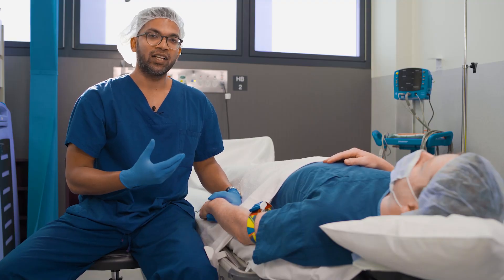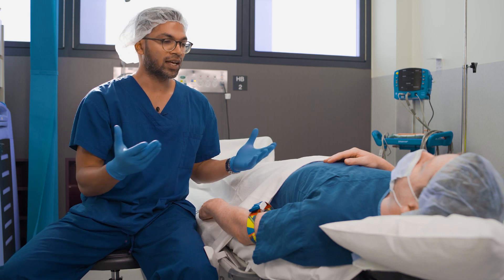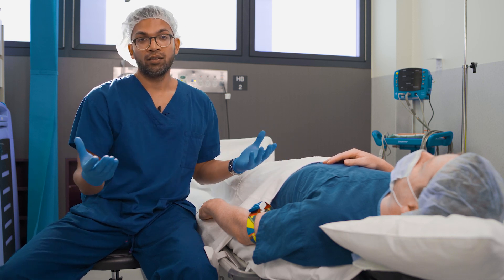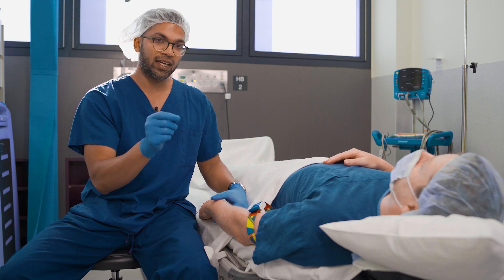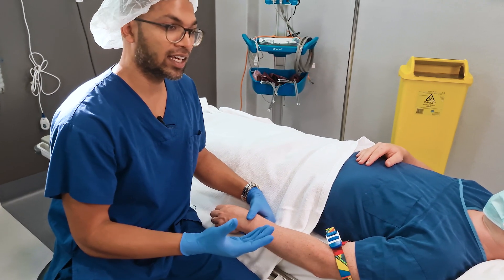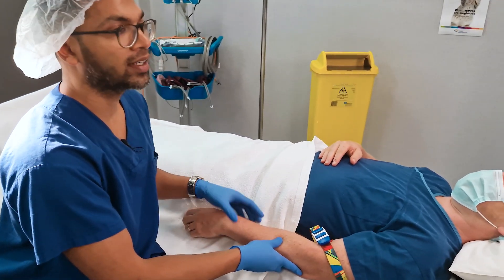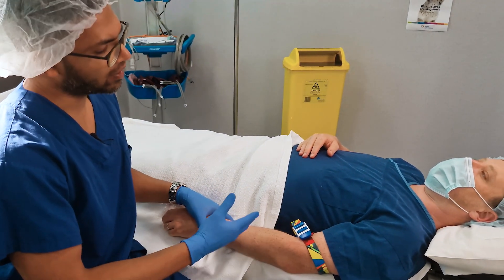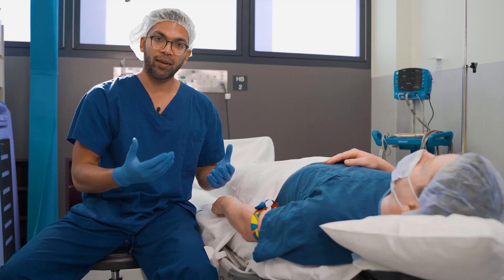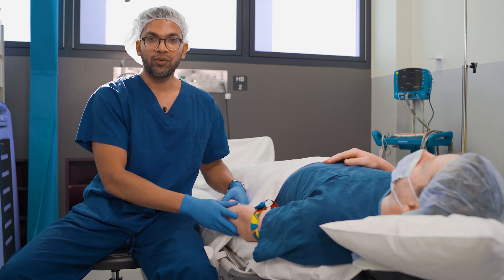I'm always thinking about surgical access. For example, in laparoscopic cholecystectomies both arms are out from the body, meaning I have access to and can observe the cannula throughout the surgery. However, in lap appendectomies they'll want the left arm in and the right arm out, so I might opt for the right arm as my cannulation arm. In other procedures like laparoscopic gynaecology surgery where both arms are in, I just leave the cannula in the left arm anyway.